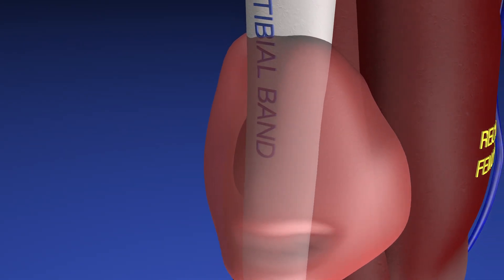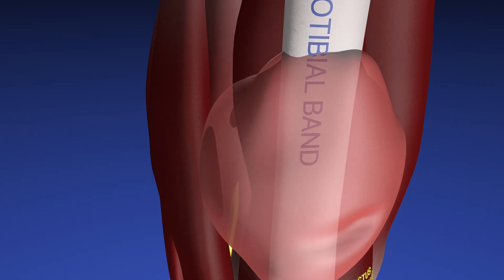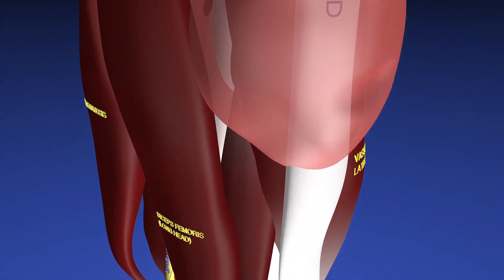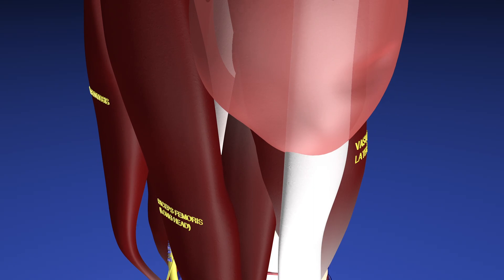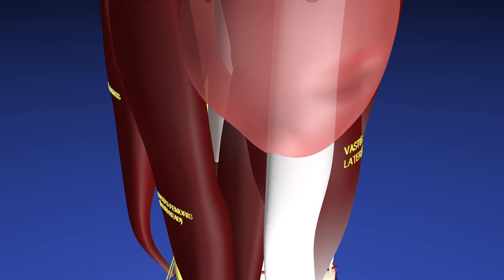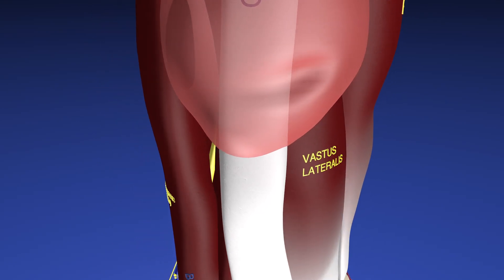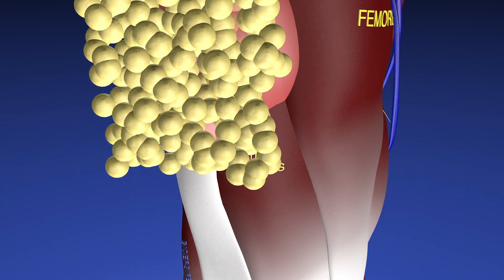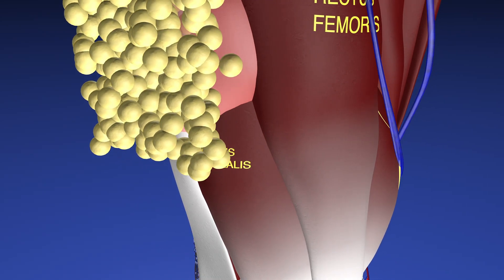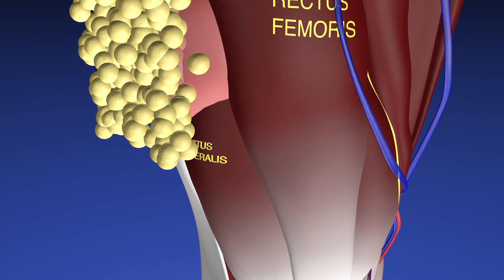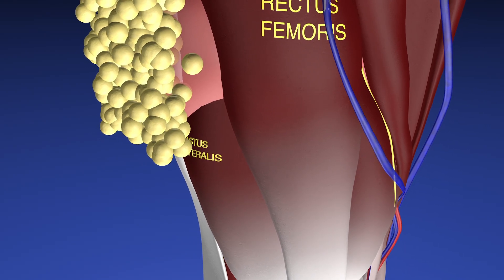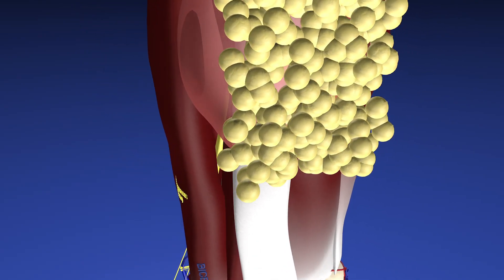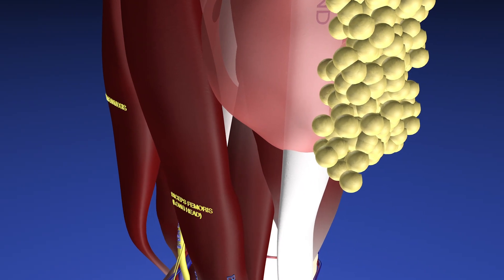There's a little indentation on the inferior aspect of this lesion caused by protrusion of the subcutaneous fat into the lesion. Here we are rotating anteriorly. You can see the subcutaneous fat on top, and you can imagine how some of that fat is basically just indenting the Morel-Lavallée lesion.